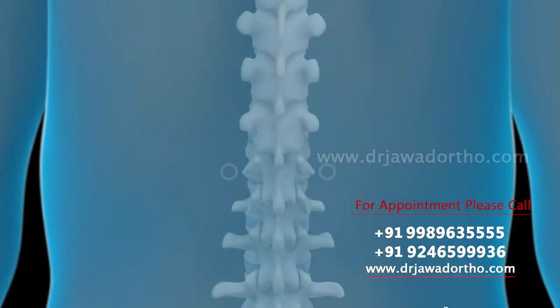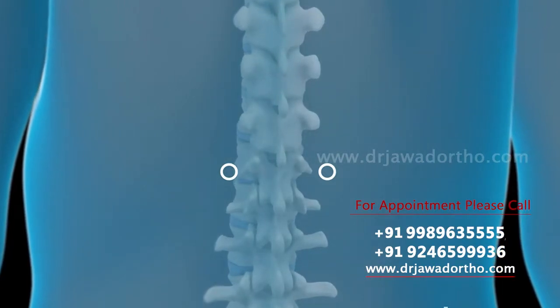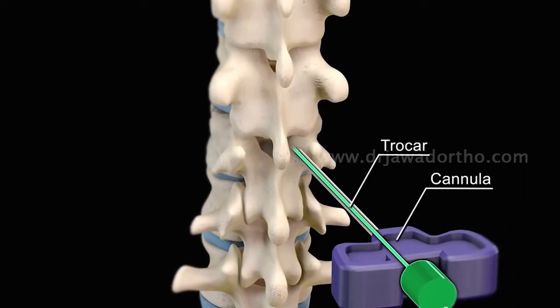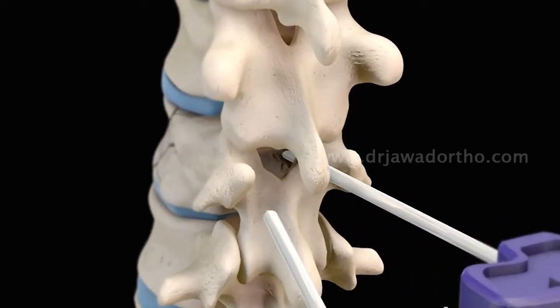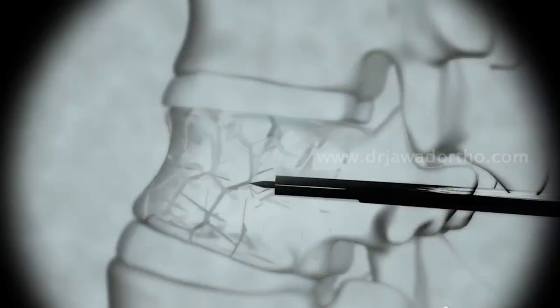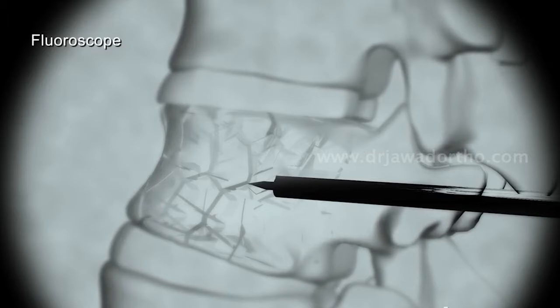Your doctor will make 2 small puncture incisions on your back over your fractured vertebra. A hollow tube called a cannula, along with a pointed instrument inside it called a trocar, will be inserted through each incision into your fractured vertebral body. Your doctor will use a real-time X-ray machine called a fluoroscope to guide placement of the cannula and trocar.